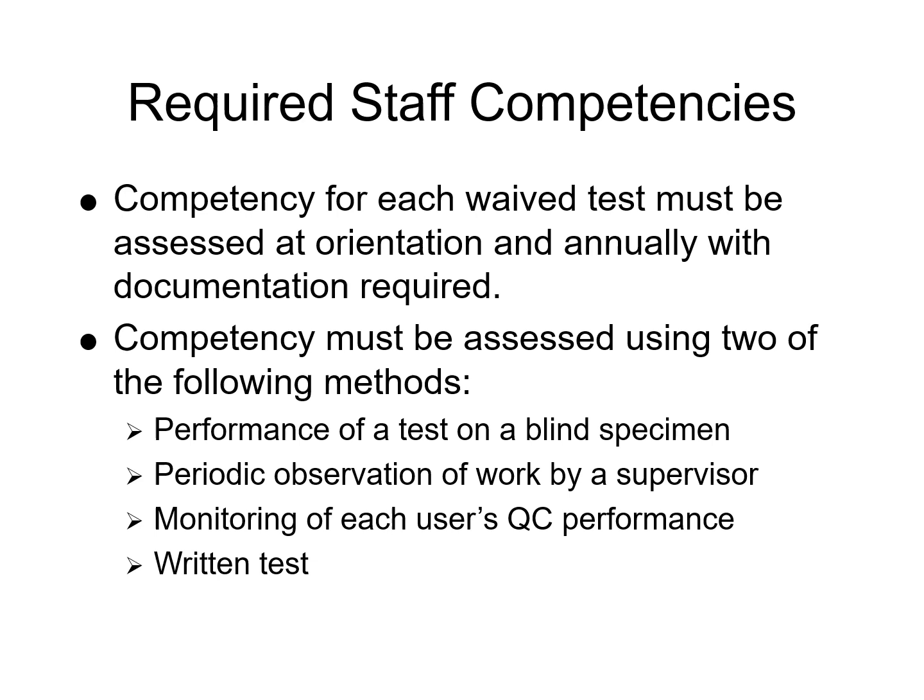Just some best practices. Again, we want to maintain those records of all competency assessments for regulatory compliance. We want to provide retraining if there are deficiencies that have been identified. And we want to ensure all personnel are aware of test procedures, QC requirements, and troubleshooting.